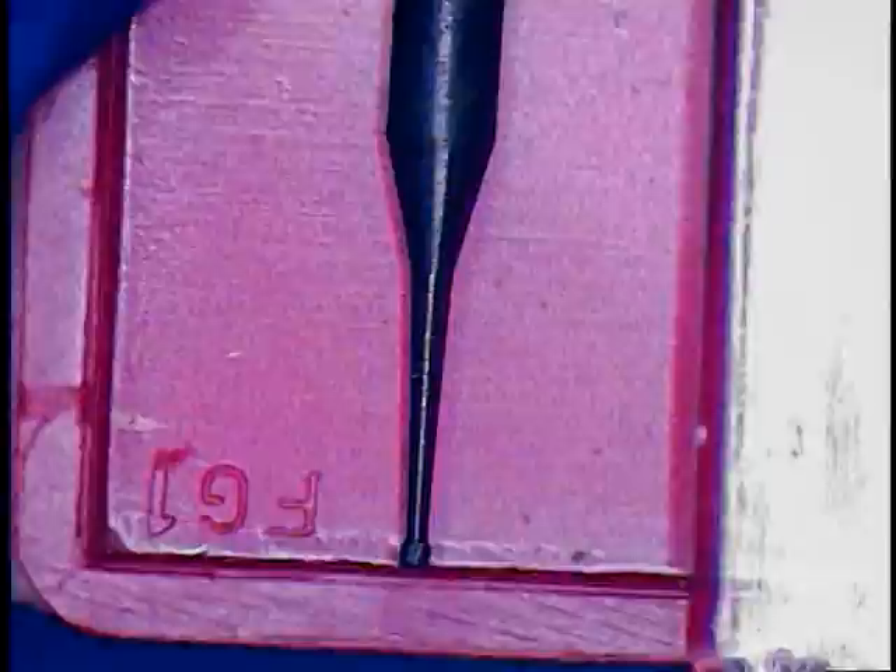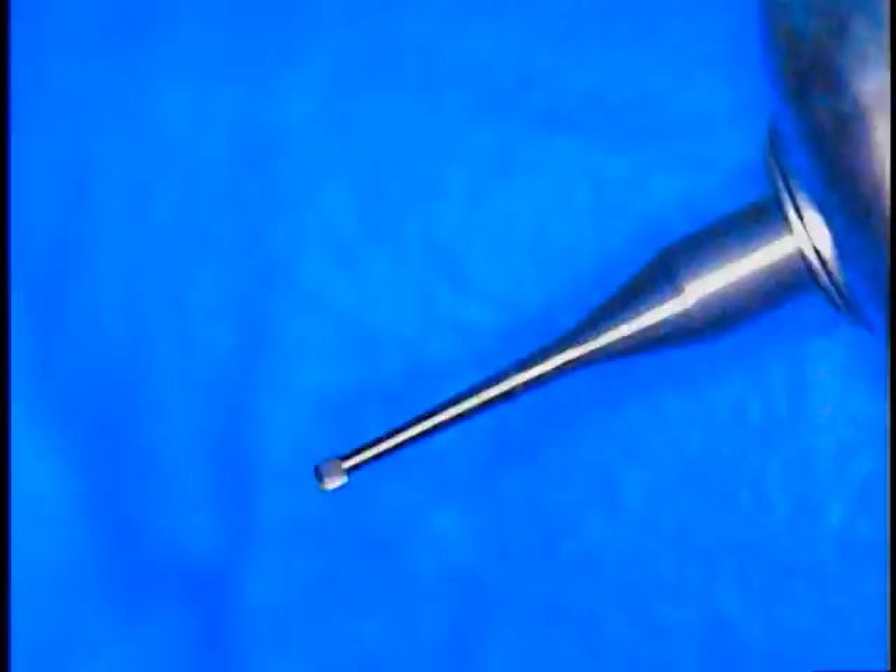I've got to do some calculating first before I enter. I'm going to take a pristine quarter round bur and put that on our handpiece. This is a slow-speed handpiece with a reduction speed and reduced vibration as well.